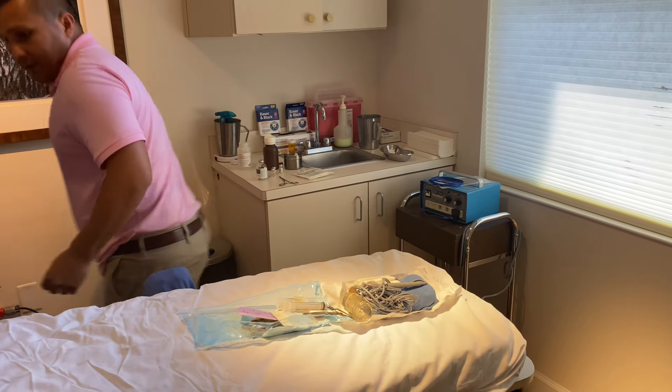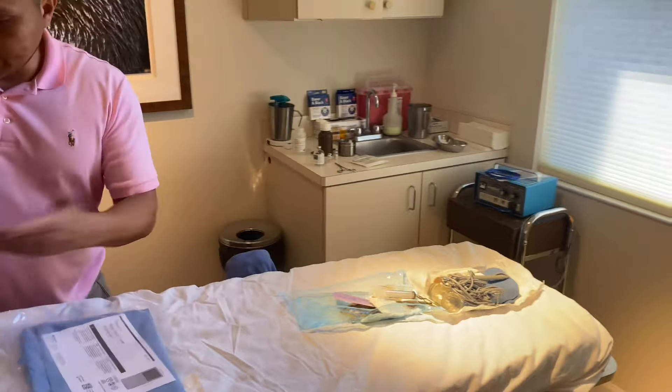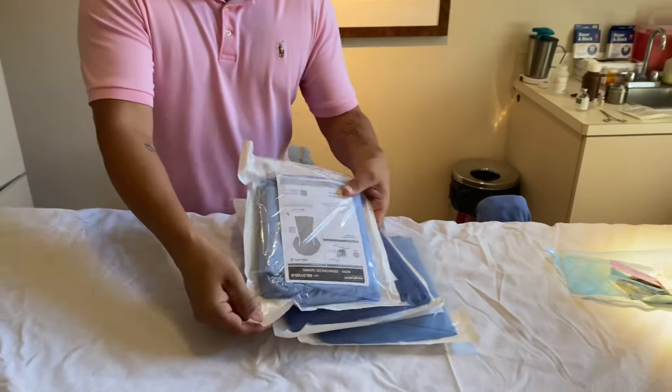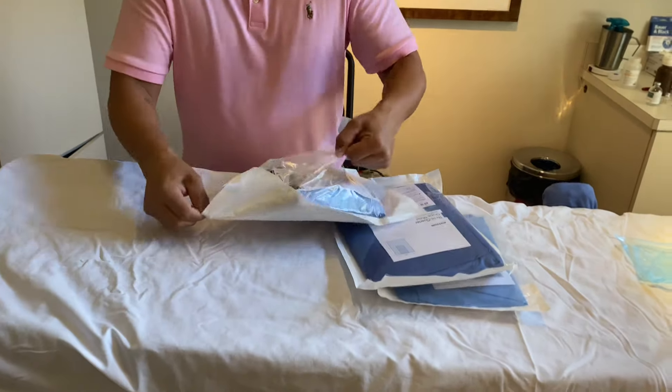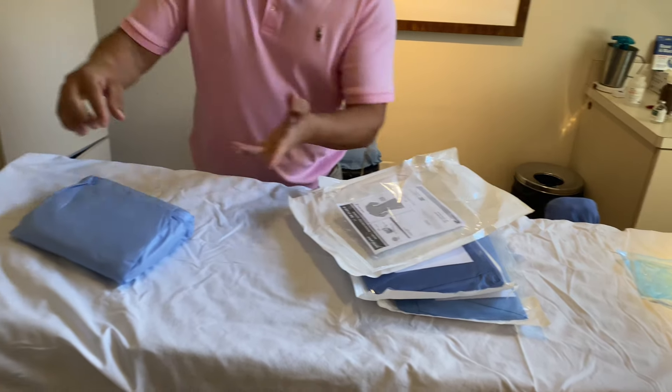All right, that's ready. So then we go to this again. You don't have to start there — you can start with this — but I always start there and then come over here. The first thing you'll open up will be the gown, and this right here is fine because it's still in the sterile field.